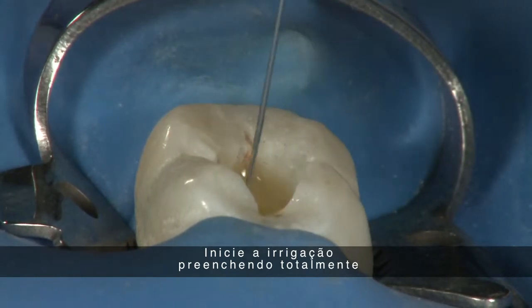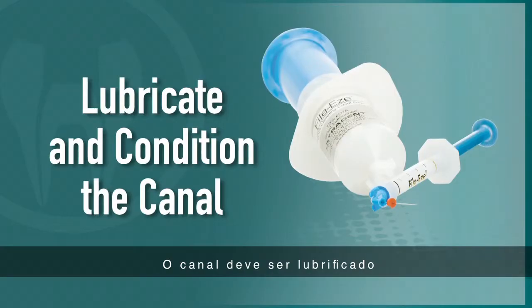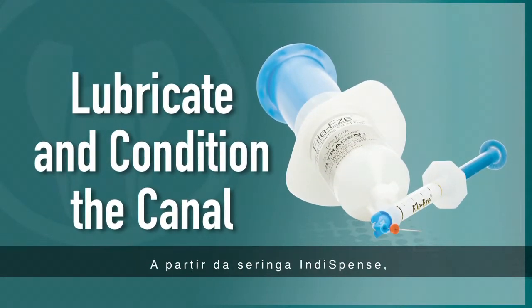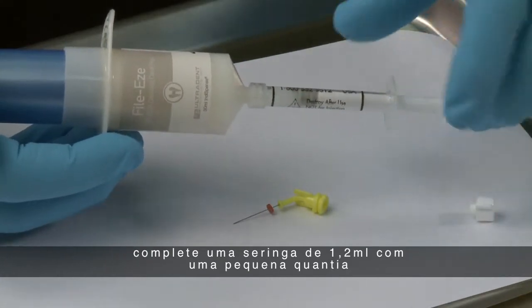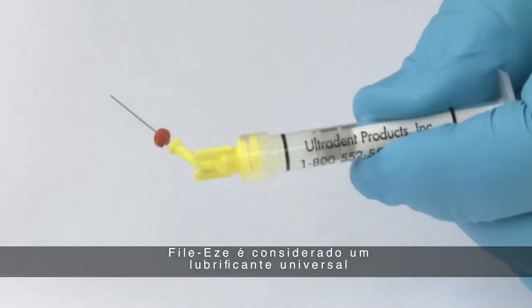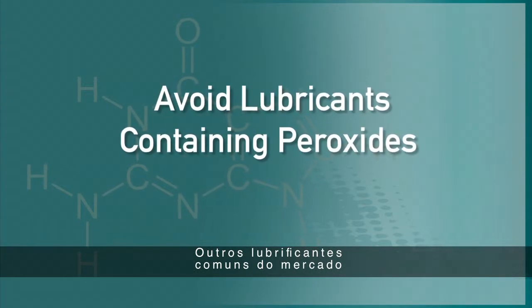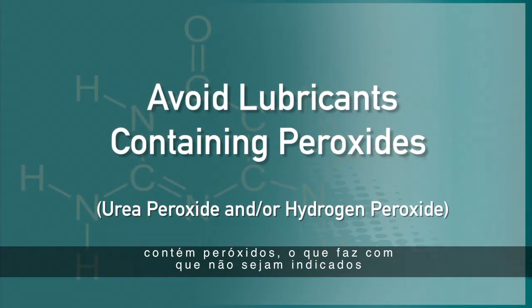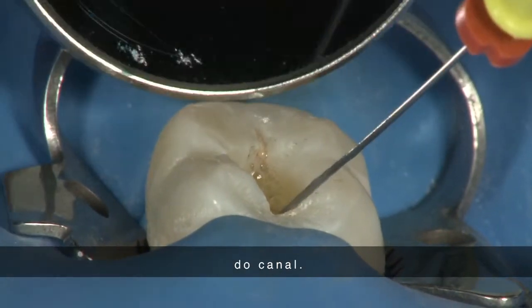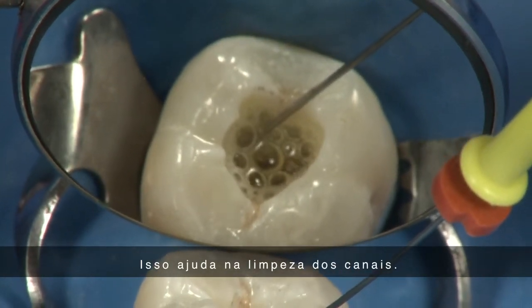Begin irrigation by completely filling the canal with ChlorCid, being cautious not to express any irrigant beyond the apex. The canal should be properly lubricated by placing a small amount of File-Eze to make instrumentation easier. From the Indispense containers, fill a 1.2-milliliter syringe with a small amount of File-Eze and place a 30-gauge Navi tip on the syringe. File-Eze is considered a universal lubricant because it can be used in conjunction with any obturation method. Other common lubricants on the market contain peroxides, making them unsuitable for use with resin-based canal sealers. Place a small amount into the orifice of the canal and notice the effervescent reaction when File-Eze mixes with the sodium hypochlorite — this aids in the cleaning of the canals.